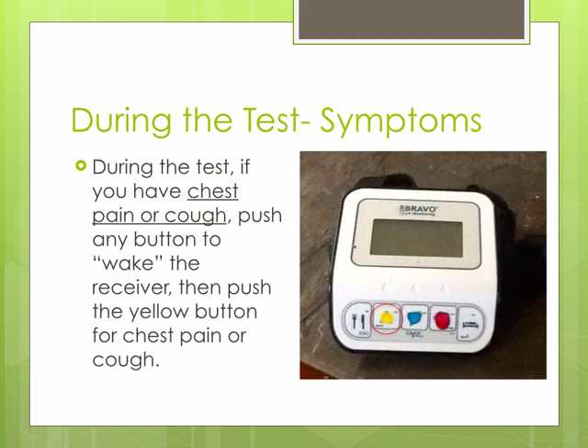The yellow button will be assigned to you if you have chest pain or cough. To indicate chest pain or cough, hit any button to wake up the receiver, then push the yellow button.